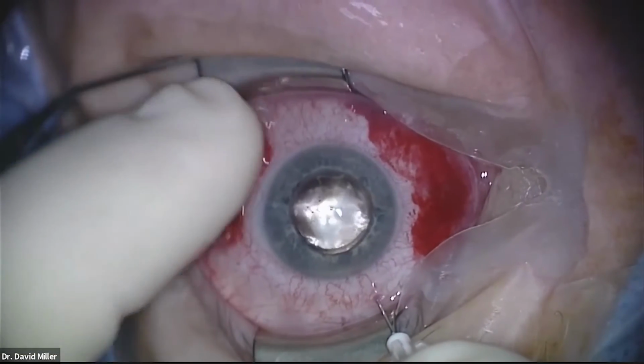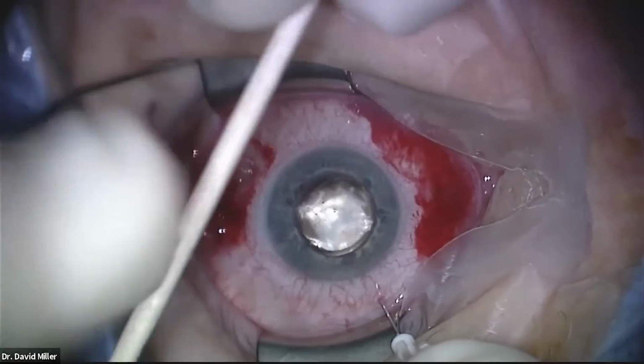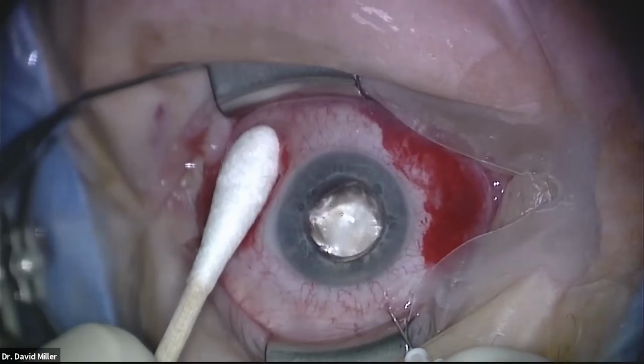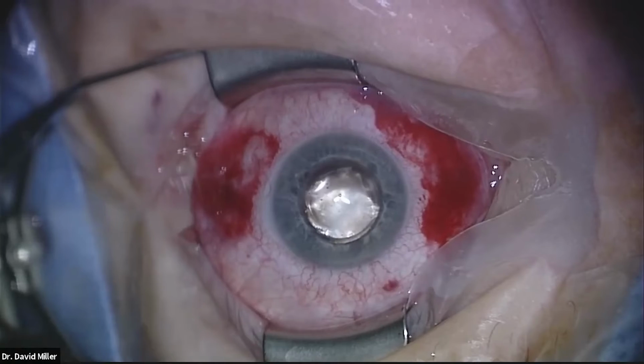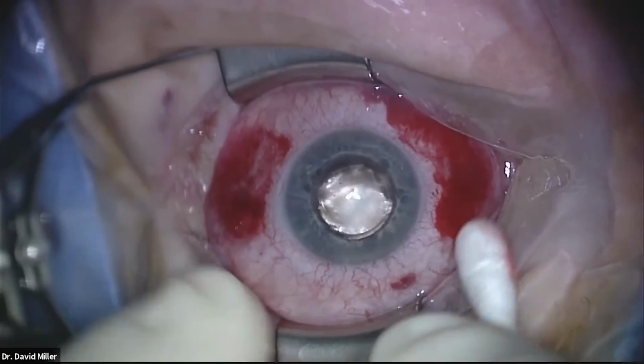So now the leak is stopped as the eye pressure comes up. There we go, a little small leak right there. Got a Q-tip. We're going to work on this leak a little bit here, which is kind of nice to show you. So first I use my finger, but we're going to wait a little longer. Quite often with the wounds, if they are leaking a little bit, it's actually kind of odd to get the infusion one that's the leaking one. More often it's the working ones.